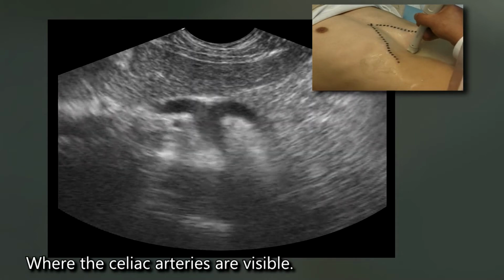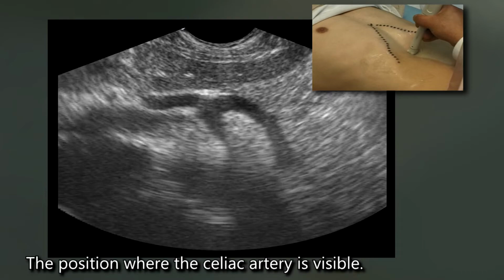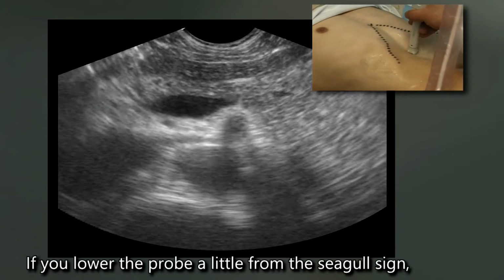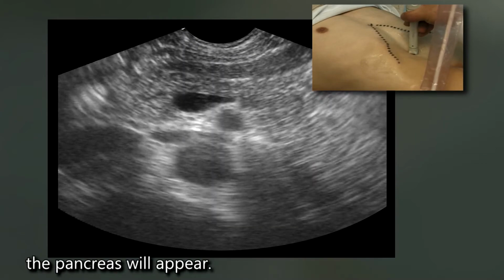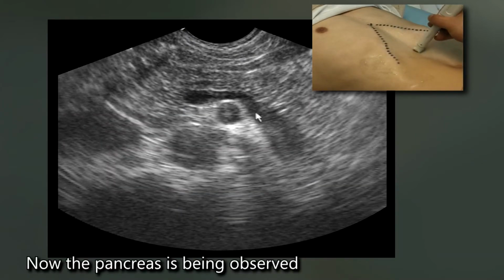This is where the celiac artery is visible. Is the celiac artery not clearly visible? The position where the celiac artery is visible. If you lower the probe a little from the seagull sign, the pancreas will appear. Now the pancreas is being observed.